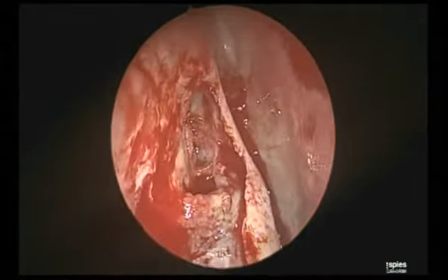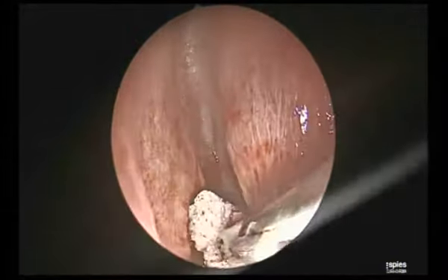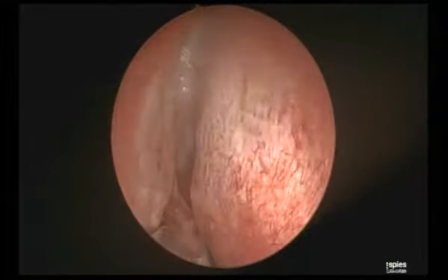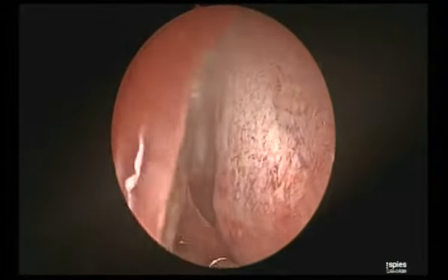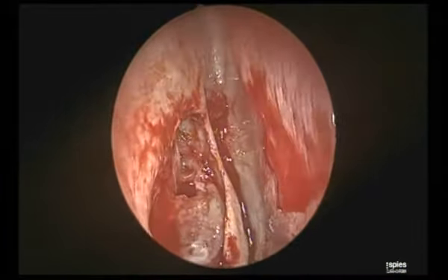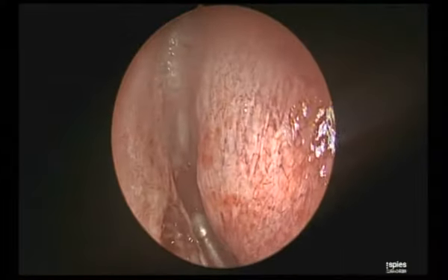See now, what I am trying to show you is how to get into the proper plane, the simplest way. At this point, again, one can get confused where to go. So mop this thoroughly. You will find the space. That's the secret. Mop it thoroughly. There's always a cleavage between the middle turbinate and that area there.